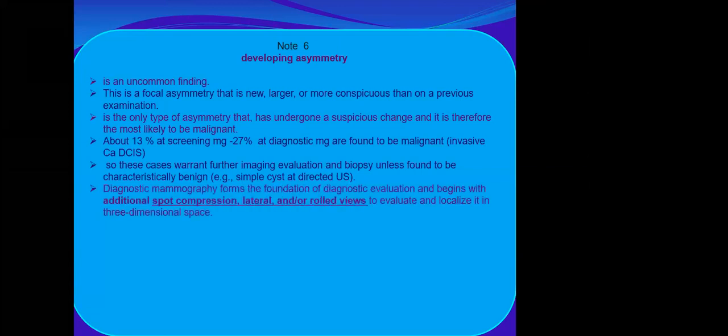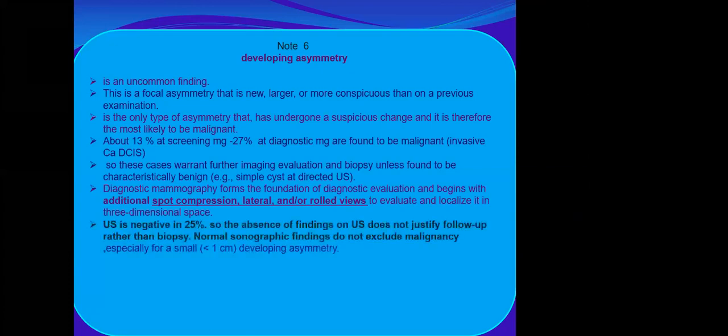These cases warrant further imaging evaluation and biopsy, unless found to be characteristically benign, like a simple cyst at ultrasound. Diagnostic mammography forms the foundation of diagnostic evaluation and begins with additional spot compression, lateral and rolled views as we described, and ultrasound is negative in 25% and should not exclude biopsy.